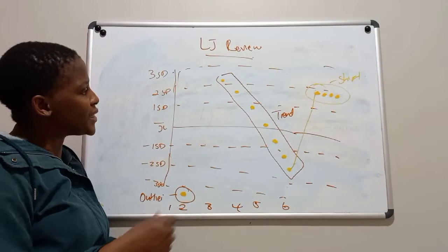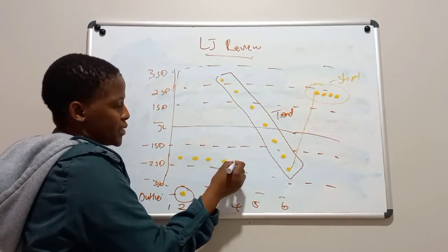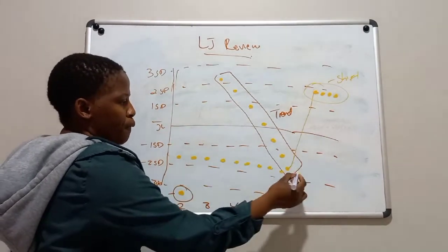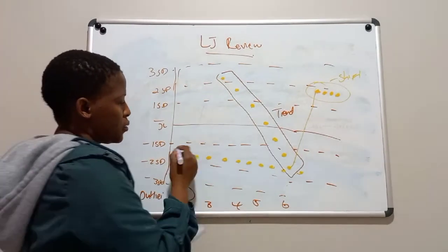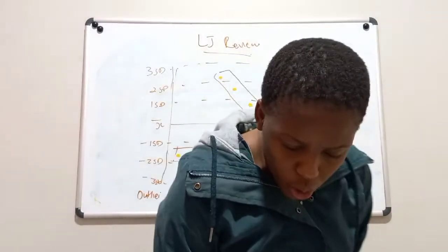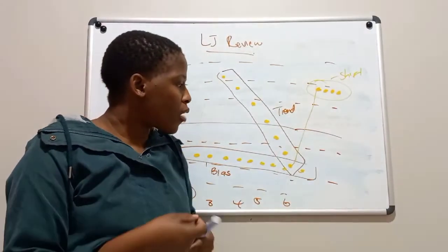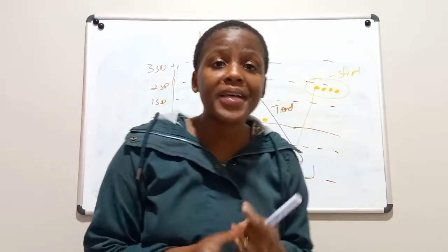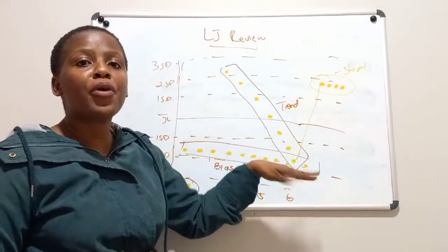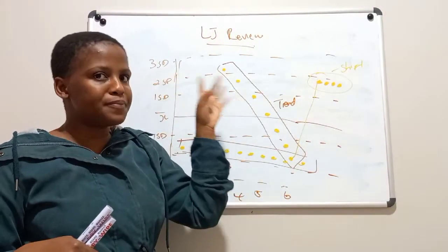So the bias is the same as that 10x. A bias is when you have 10 consecutive points on one side of the mean. Like that, for example. So once you see consecutive points on one side of the mean, then you will start thinking of a bias. And a bias can be either a positive bias or a negative bias. A negative bias is like this example that we have here, whereby your points are on the negative side of the graph. And a positive bias will be on the positive side of the graph.